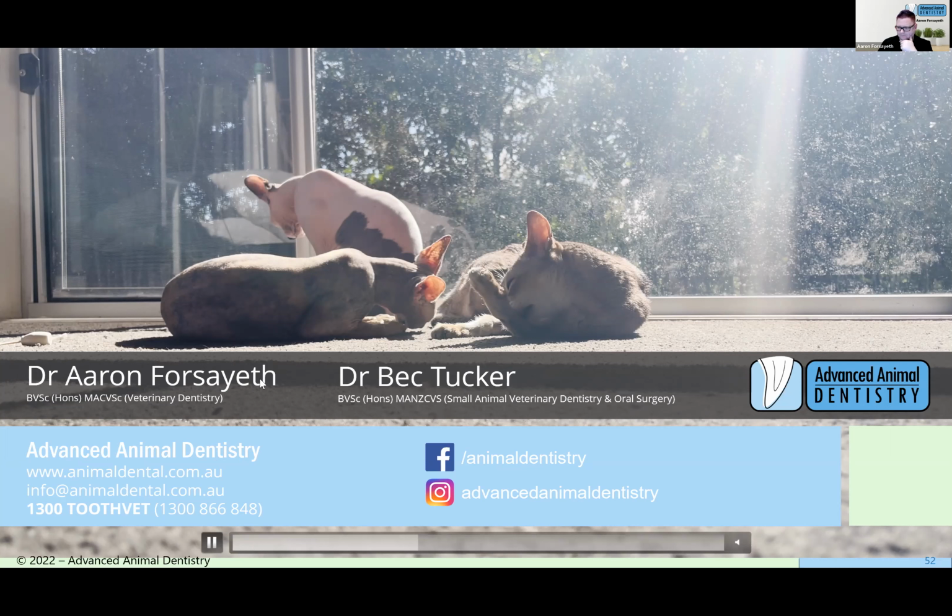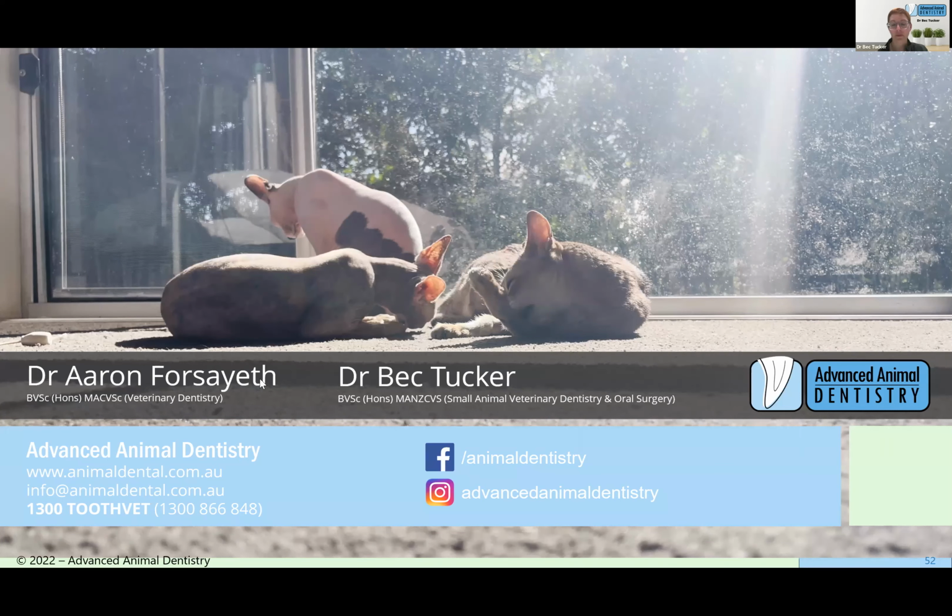Karen has one more. Do we take the orthogonal view when looking for horizontal bone loss on the side of tooth only? No, I use my perio probe. I think perio bone loss is a good one, where people put too much emphasis on x-rays. It's a physical exam. It will pick up horizontal bone loss. It'll pick up vertical bone loss when it's on the mesial or distal surface. If it's on the buccal, lingual, or palatal surface, you'll often miss it.